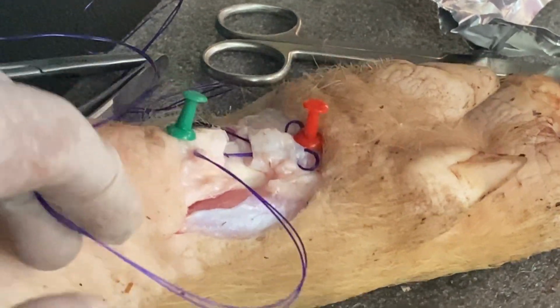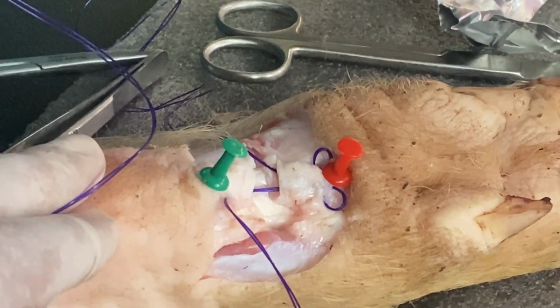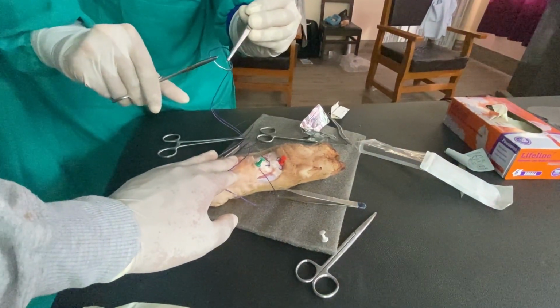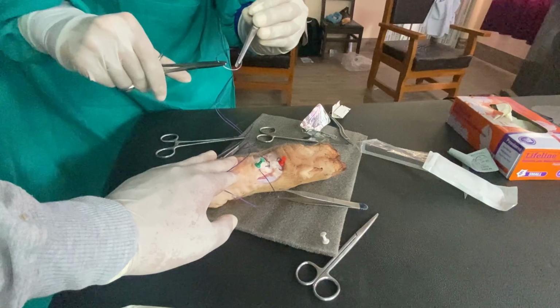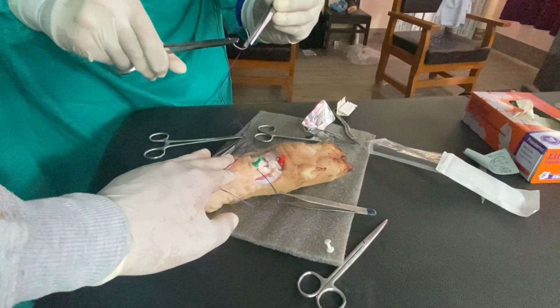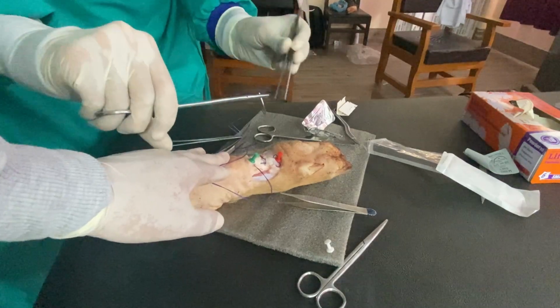Now you need to orient your needle first. Yes, that is the orientation. If you hold it at the distal end of the needle, it will be difficult for you to suture. So you need to be proximal.